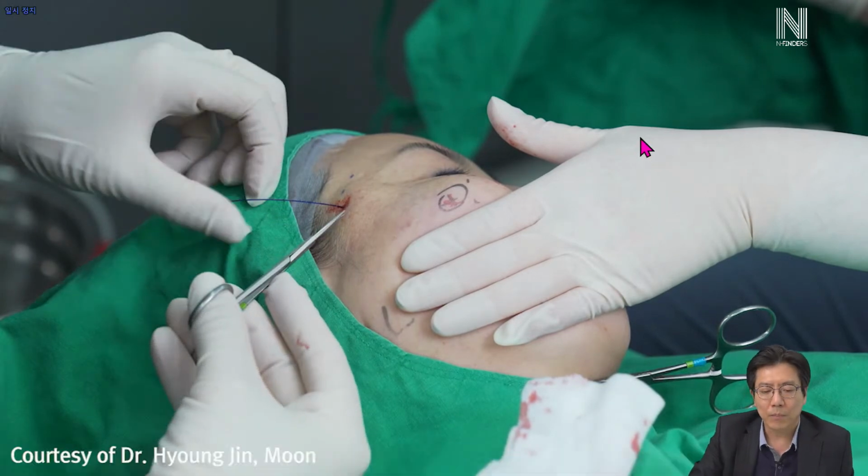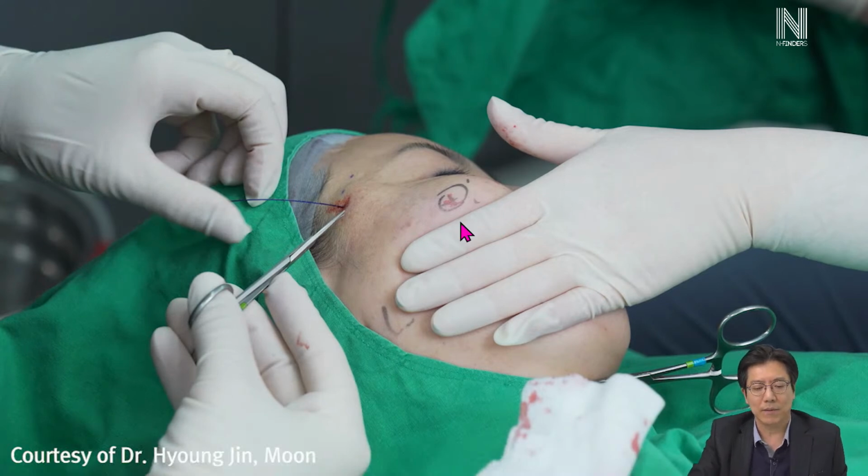And please focus on the hands, the beautiful hands. And why do we lift up the mid face? To prevent some complications. One of the common complications after thread lifting is thread extrusion from the entry point, especially when patients smile.